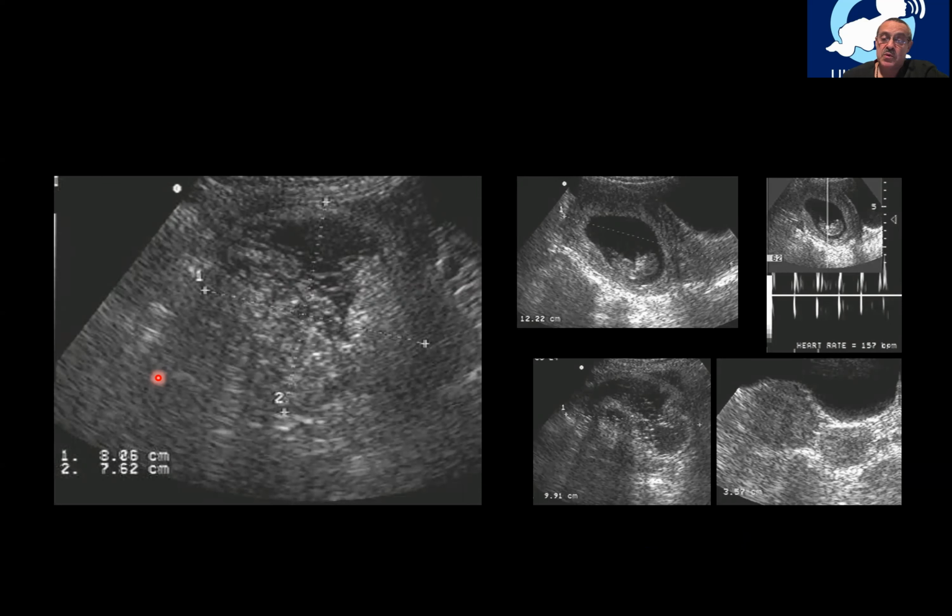Say patient, which, by the way, was pregnant. We can see a lot, like a 9 weeks baby inside with the heartbeat.